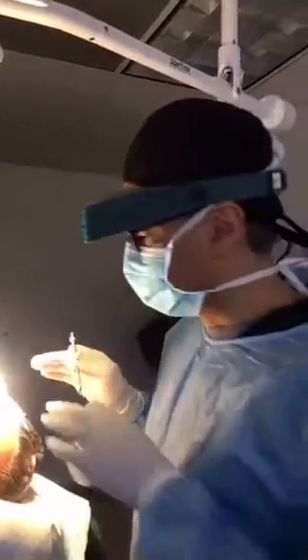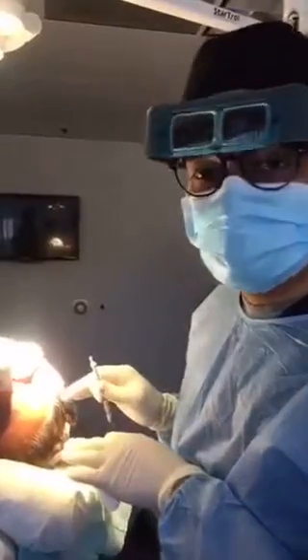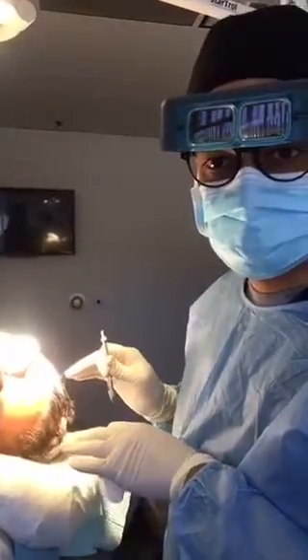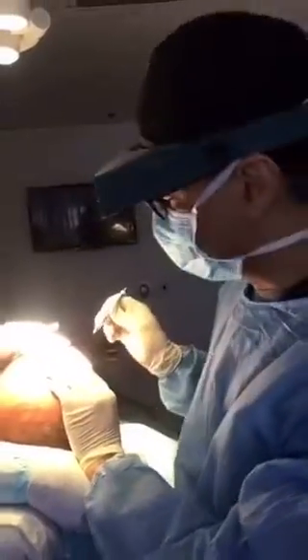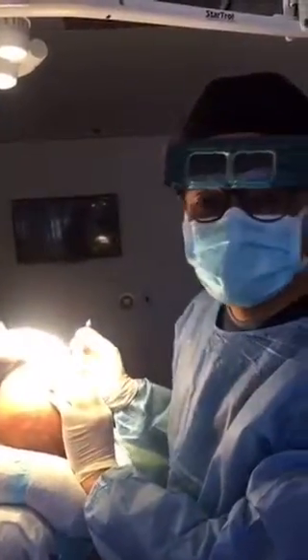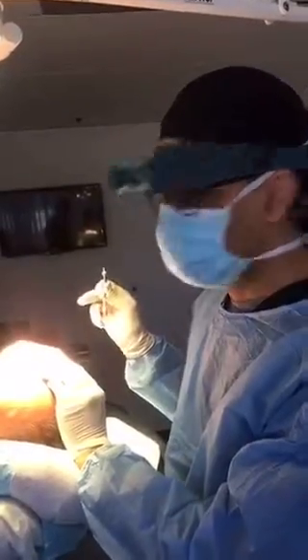We're doing 1,500 plus grafts with a strip procedure today. He had two strips before. We're going to reinforce the frontal hairline and eyebrows too.